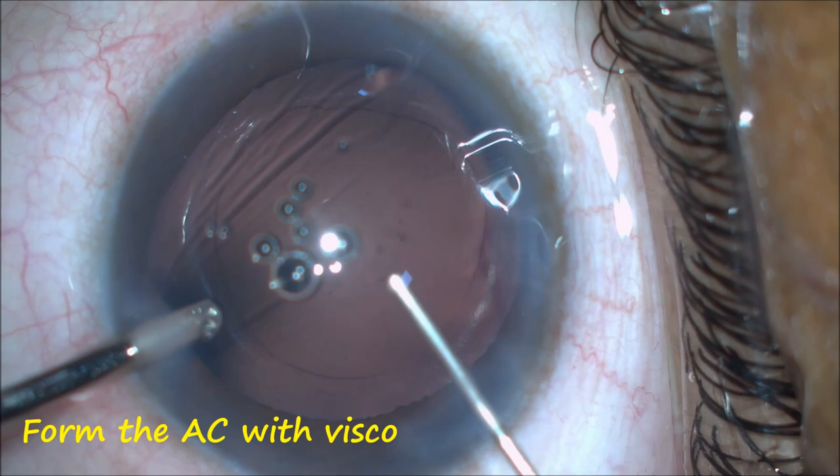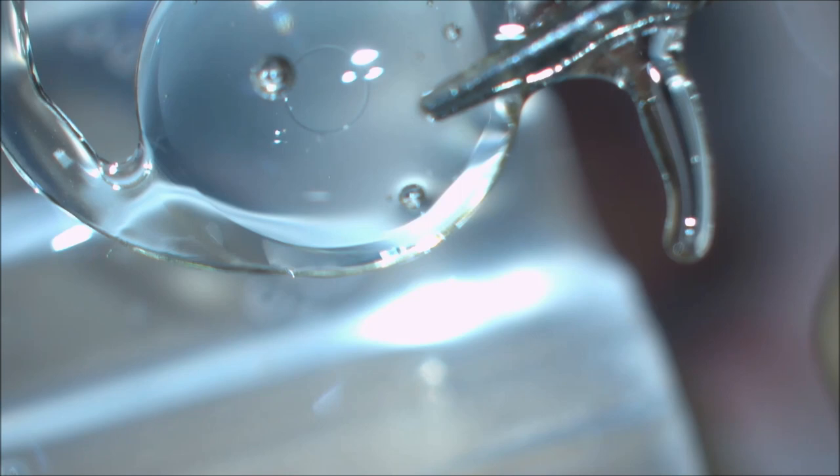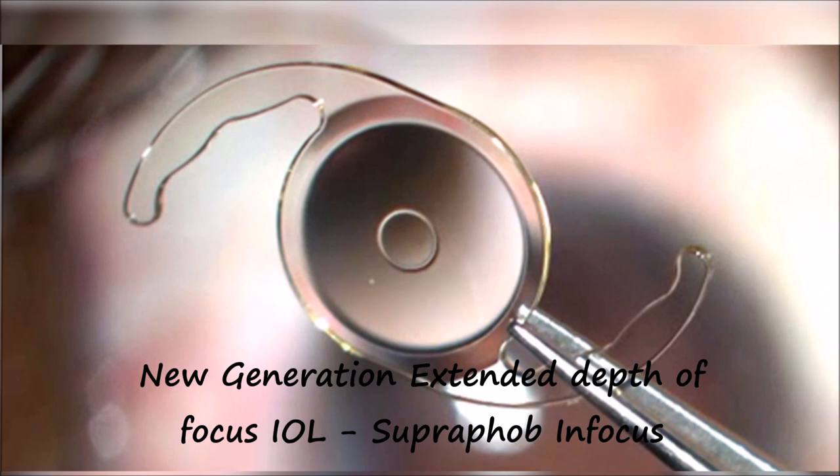After irrigation and aspiration, the anterior chamber is formed with high-density oculoviscoelastic devices. The new generation extended depth of focus IOL, the Supraphobe in FOCUS, is implanted.